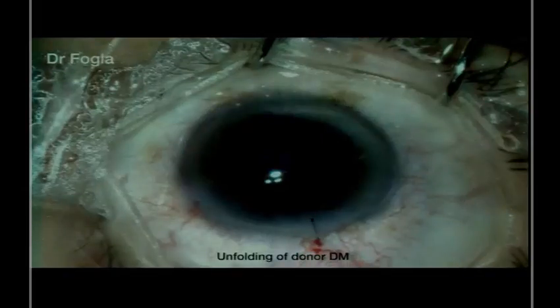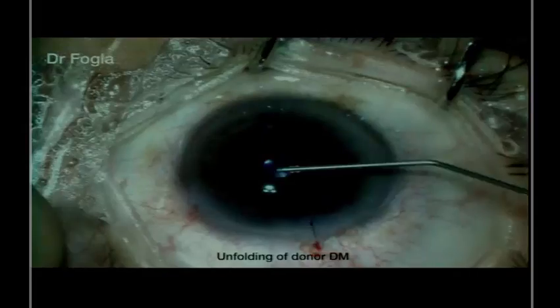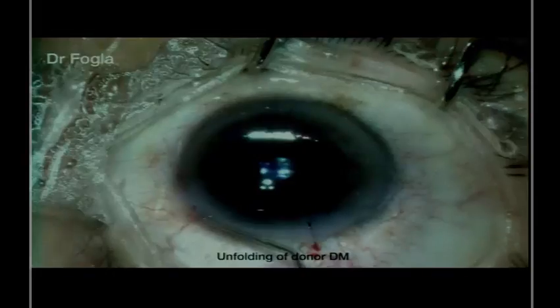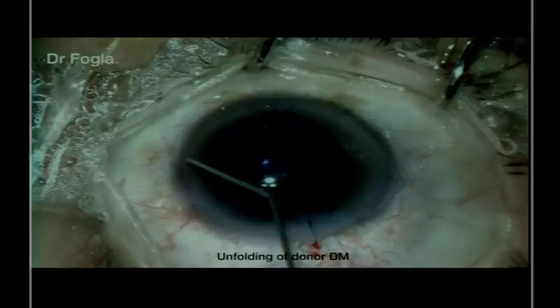And once it is, you can see there, I want to open that, so I just tap the surface centrally, the fluid wave goes ahead, and it's well centered. Once it is there, you can put in an air bubble, and that's it.